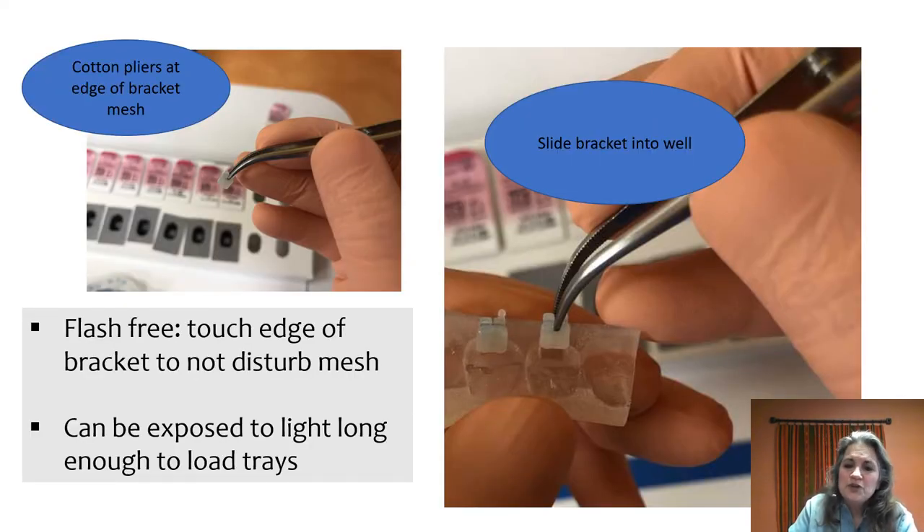When working with a flash-free bracket, you want to be careful — just touch the edge, you don't really want to grab it in the middle. Slide it into the well; you can see how it fits snugly. You do have enough time to insert all of them and then put the tray away. After seating all the brackets, invert the tray upside down and gently shake it to make sure all the brackets stay in place. If you have a good tray design and followed good post-processing practices, the brackets should stay in when inverted.